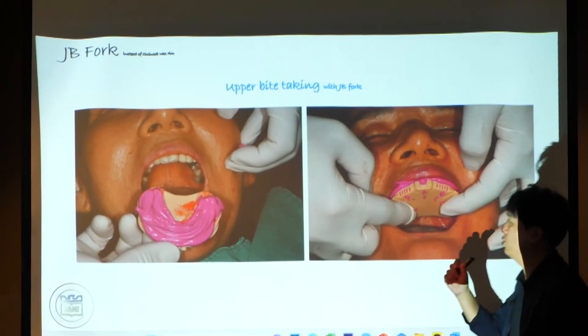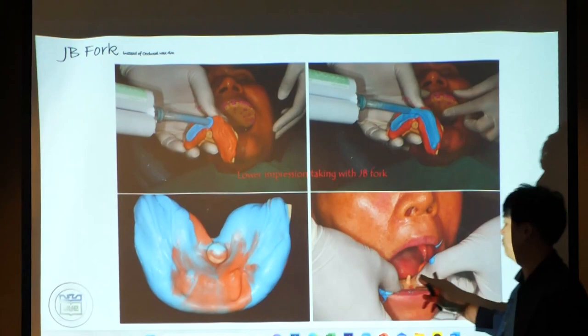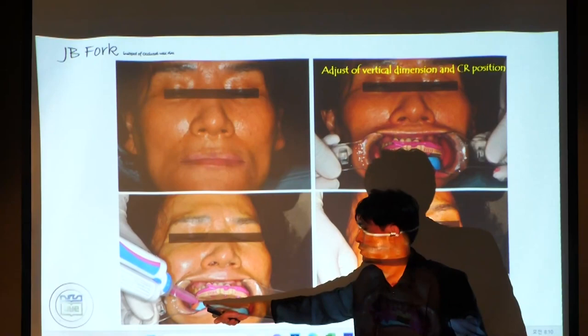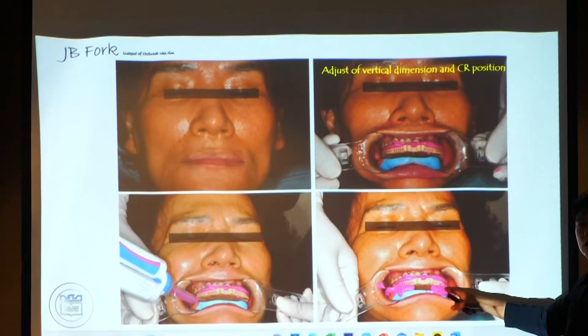You simply put this plate with the silicone material, put the rollers on very simply, and adjust the screw pin. Take the CR point and the vertical dimension, and then put the bite silicone material like this. It's very simple, and it's not necessary to make a cross-mounting. I took about 10 minutes to detect the jaw relation using the JB fork.